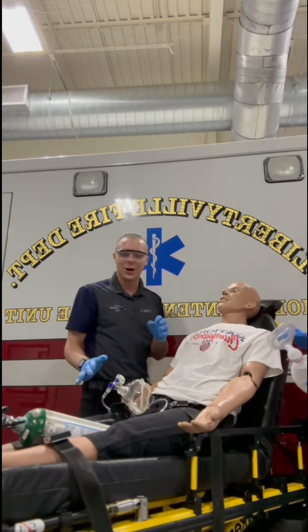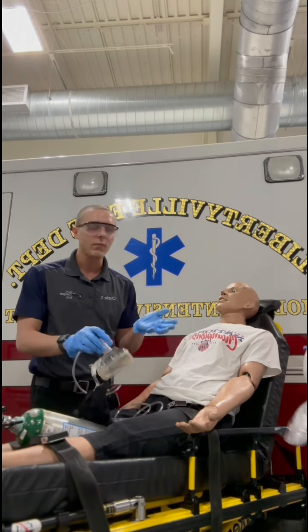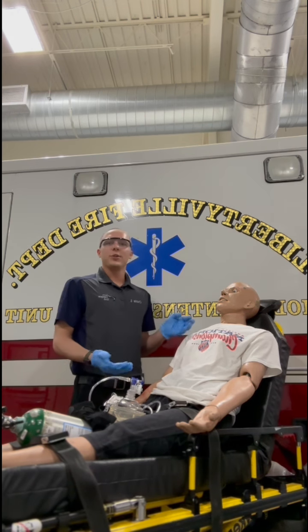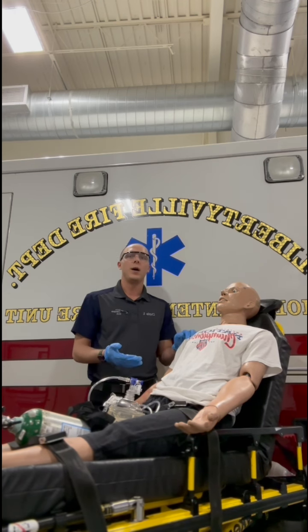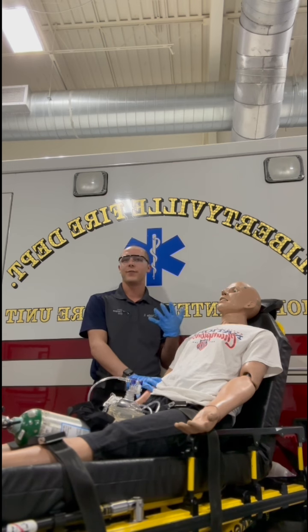So with CPAP, a lot of CPAPs have connectors that come between these 2 so that a dual neb can go in along with the CPAP. So that's pretty cool. When you're transporting a patient in CPAP, you're also going to want to call the receiving medical facility and let them know you have a patient on CPAP so they can be prepared and set up their CPAP machines for you. And as well, a patient on CPAP is most likely going to be in critical condition, so you're going to want to reassess every 5 minutes.